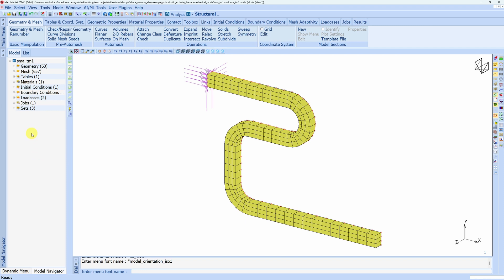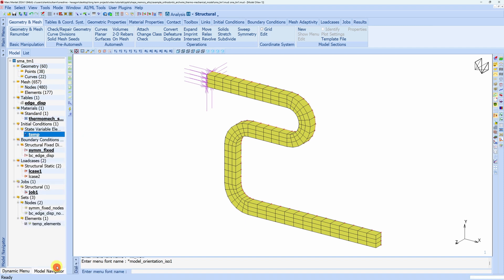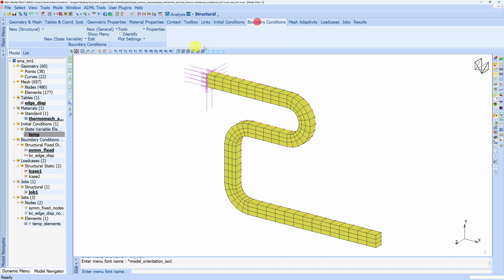Anyway, so let's see what we have here. I'm going to expand all the folders. Of course we have this wire. Then let's go to boundary conditions and see what boundary conditions we have. On the top we have a fixed symmetry boundary condition and on this end we have a displacement boundary condition.